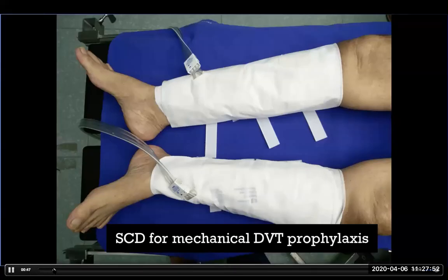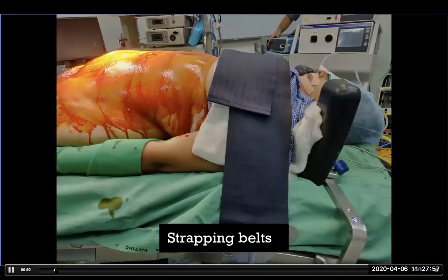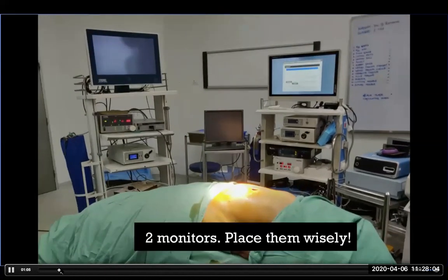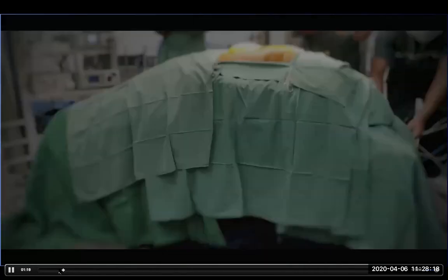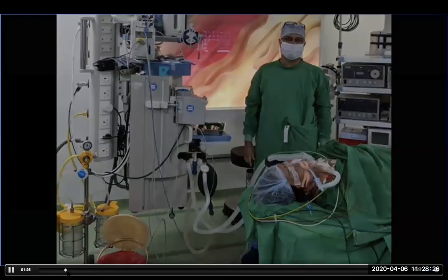I would recommend that your patients be well padded, and you must strap the patient, have mechanical DVT prophylaxis, and use your monitors. You may be needing to shift them towards one or the other side, maybe towards the foot end at some point. And you break the table at the level of the costal margin around 30 degrees so that your hand does not hit the patient's face when you're standing at the patient's head end. Okay. The anesthesia team must give enough space at the head end so that the surgeon and assistant can stand there.